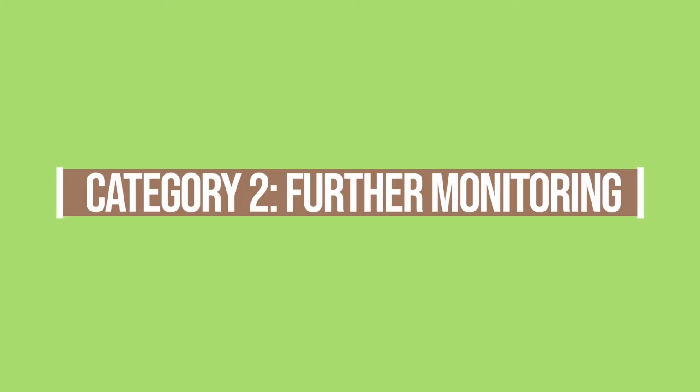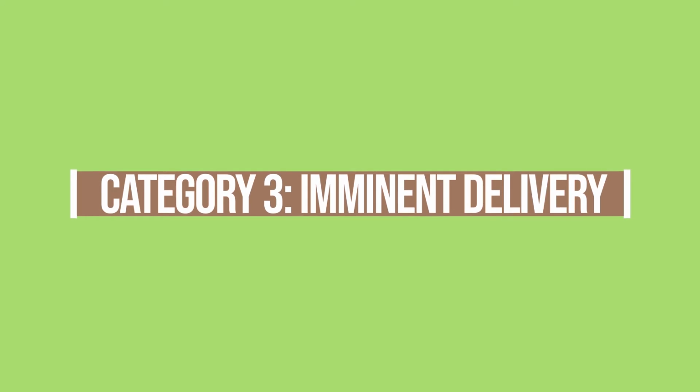After we've done a complete non-stress test, which is a period of time of 20 minutes to an hour, we will assign a reactive status to your baby or a non-reactive status to your baby. Or we will categorize it category 1, means healthy, category 2, which means we need further monitoring, or a category 3, which means imminent delivery.